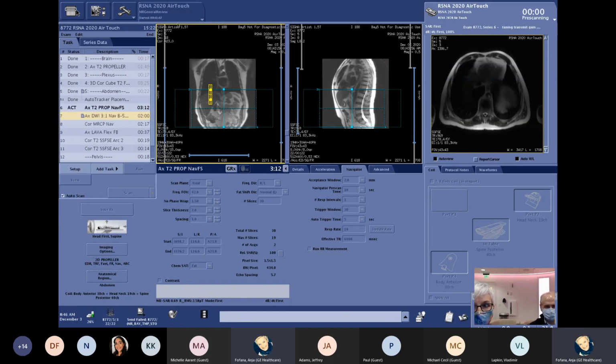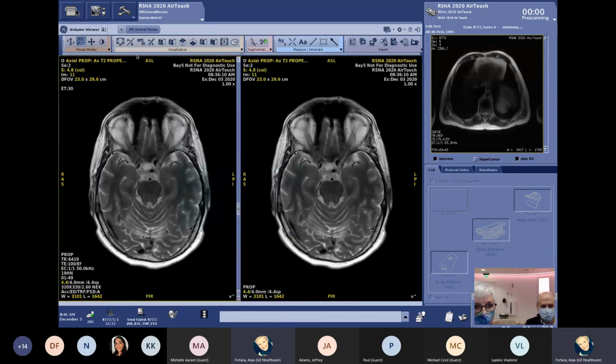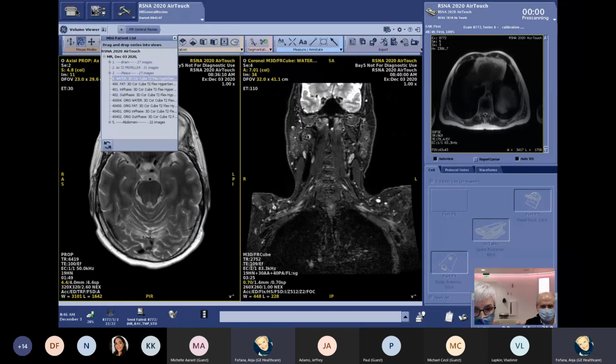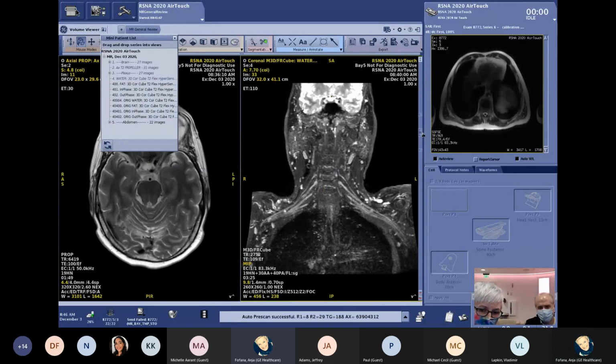And while this is running, we can look at our images which we acquired for the neck, for the plexus. So I will load the middle slice here, and then you can see when I bump up how nicely now you can see the nerve roots here. And since we scanned with the air coil on top of the head coil, you see that you can go through the entire nerve roots until they hit the humerus.